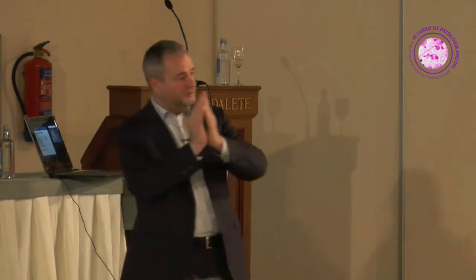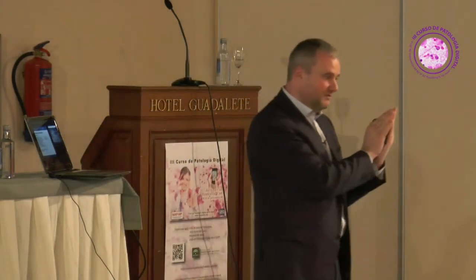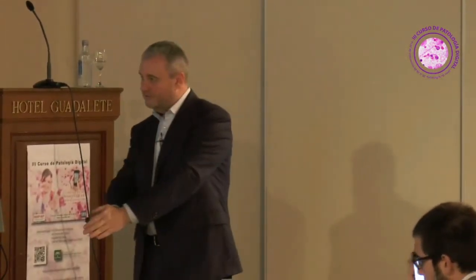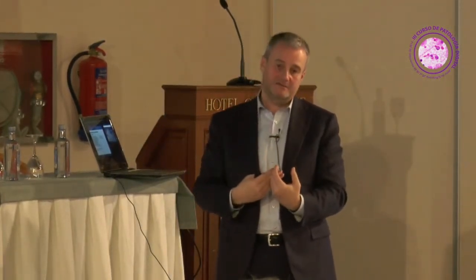We are using a new principle that I don't have time to talk about, called virtual double staining, to identify the tumor cells. What this means is that you can do workflow reassignment in the lab and push a lot of the work to technicians. The technical aspects of the image analysis work can be pushed to the technicians. They push the results to the LIS or the Omnyx system, and then you open up your work list and look at all the cases that have been analyzed.